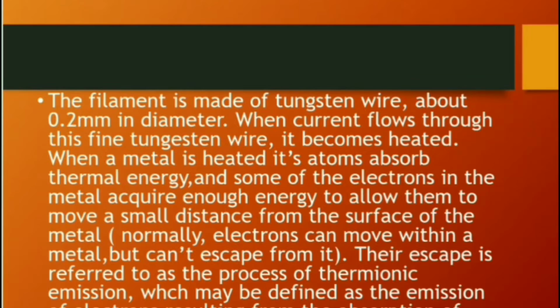One wire supplies voltage. Voltage means the force which makes electric charge or electrons move. So it is energy per unit charge, which here is on average about 10 volts. And the amperage here is 3 to 5 amperes. What does amperage mean? It's the rate of electron flow. Simply, it's the electric current which we give to the filament or cathode, which is 3 to 5 amperes. I told you that, and that is needed to heat the filament.